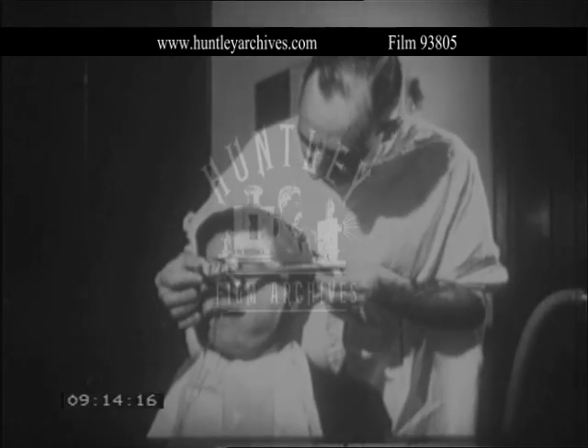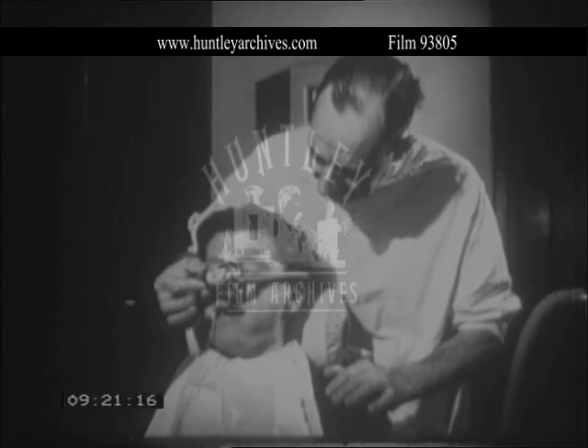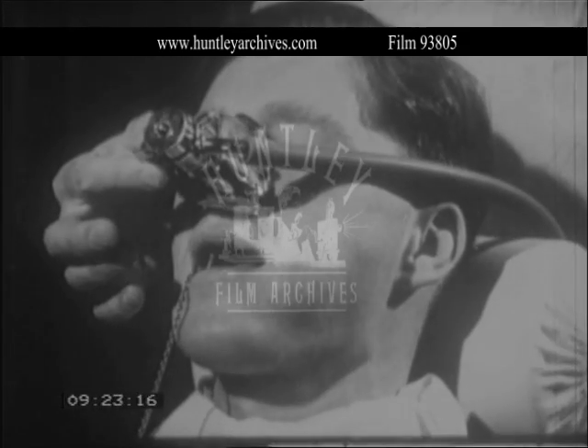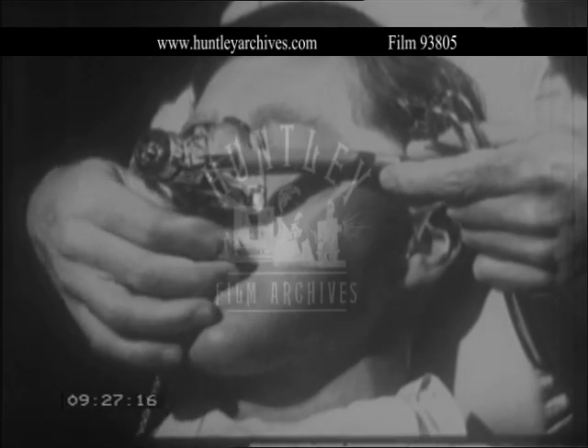Start the induction with nitrous oxide. When the patient is ready, introduce a mason's gag and open just sufficiently to remove the baby prop.